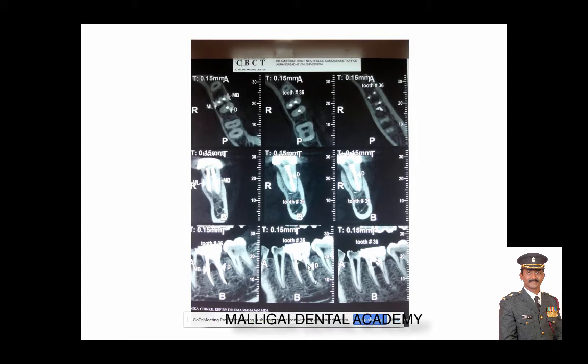So also there's a strip perforation because of over preparation of the root canals, over preparation by rotary instrumentation, which is causing failure of the root canal treatment. So I know that I can probably expect a furcation involvement here, a furcation perforation and strip perforations related to the coronal aspect of the mesiobuccal and the distal root canals. So much information is available today even before I begin the root canal treatment. So the CBCT can be used to our advantage in modern endodontics.